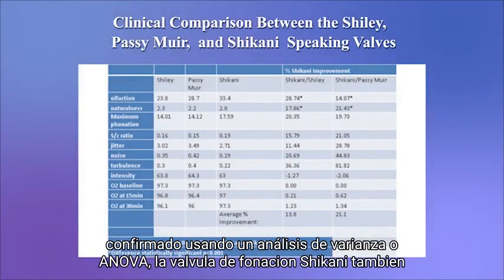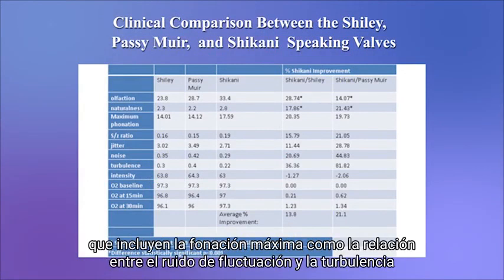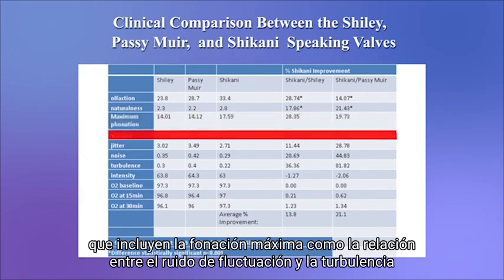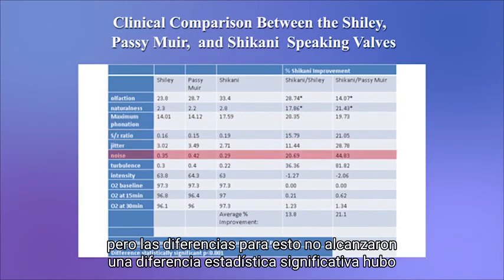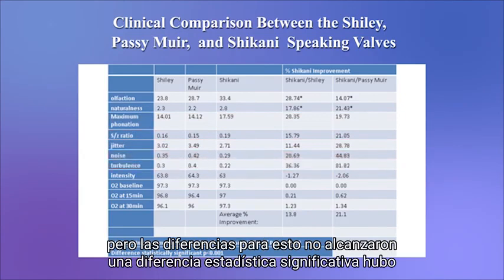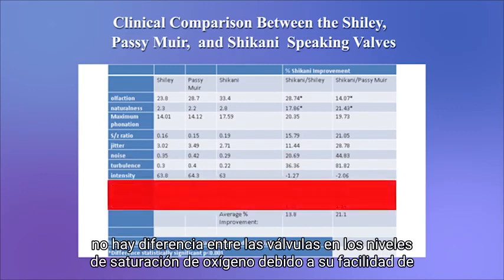The Shikani speaking valve also proved to be superior to the Passy-Muir and Shiley valves in the general speech parameters, including maximum phonation, S/Z ratio, jitter, noise, and turbulence. But the differences for these did not reach statistical significance. There was no difference among the valves in oxygen saturation levels.